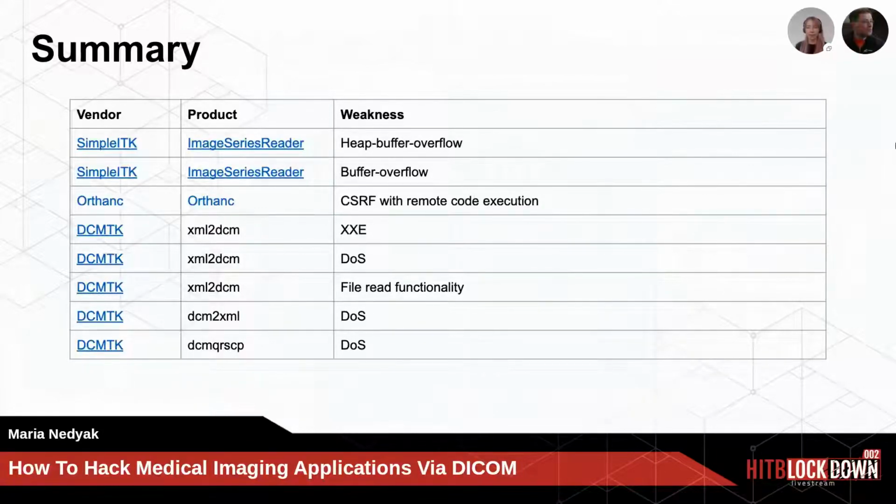And I think that the DICOM community and vendors mostly pay little attention to the confidentiality and security of their services.